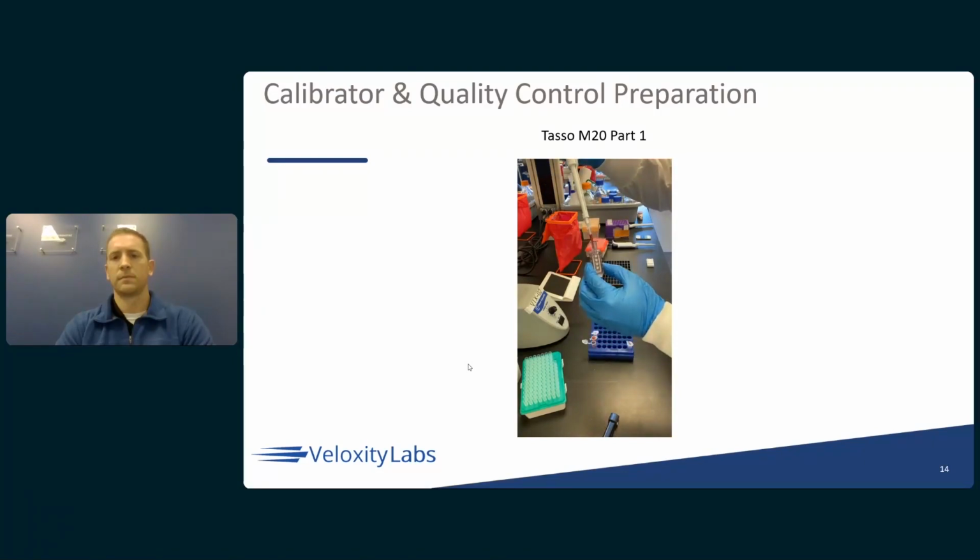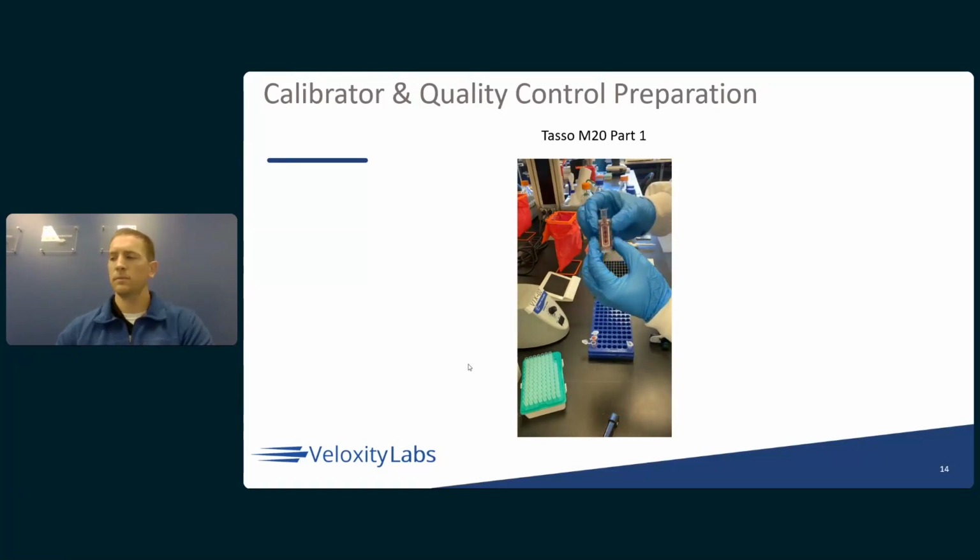We're going to slowly insert the pipette and allow that microfluidic technology to allow that blood to flow down on the different cartridges. And you'll see once it gets past that fourth cartridge, there's a little excess waste for it to catch the extra blood.